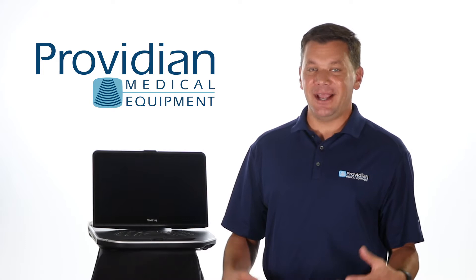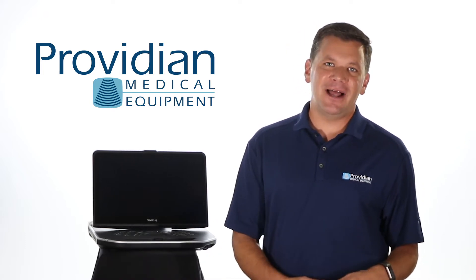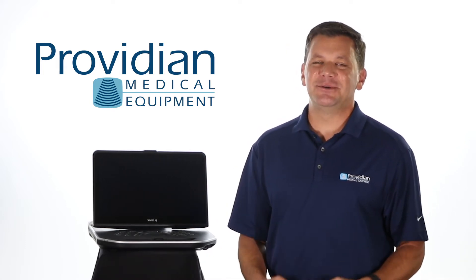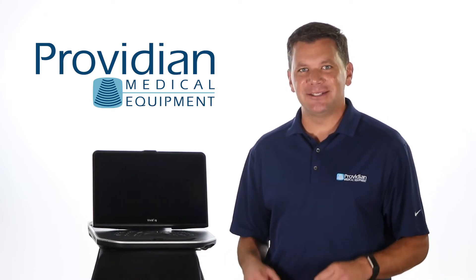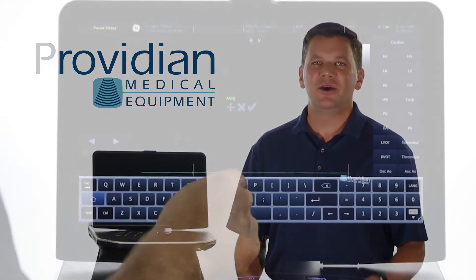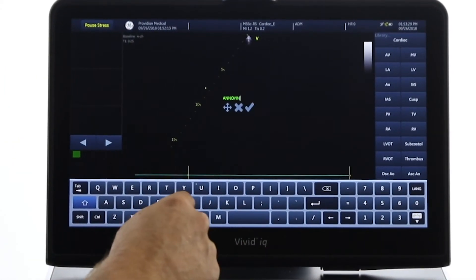I opened the lid and I was like, 'Cool,' and that quickly followed into, 'You have got to be kidding me.' There's no physical keyboard. This is an advanced cardiovascular ultrasound machine, and you're stuck with a touchscreen keyboard.